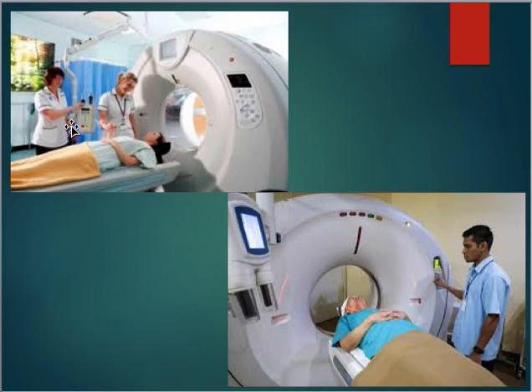So what we have here are these power injectors. So the patient would have an IV, we'd hook them up to this, and then we can control this back behind the console. So we can determine when that patient gets the contrast and how much they get without ever stepping foot into the room with the radiation.